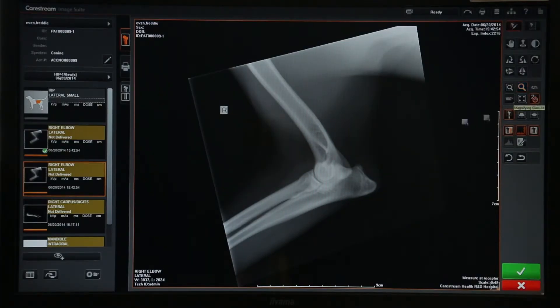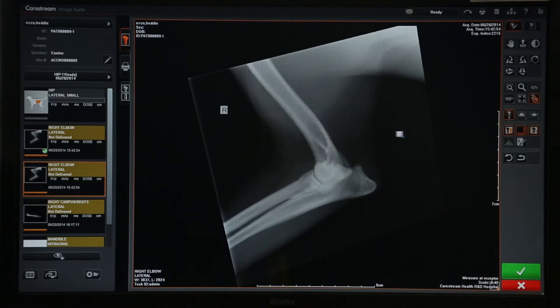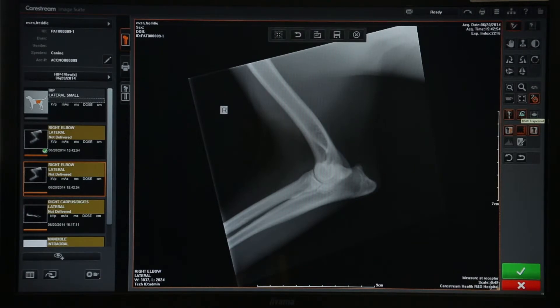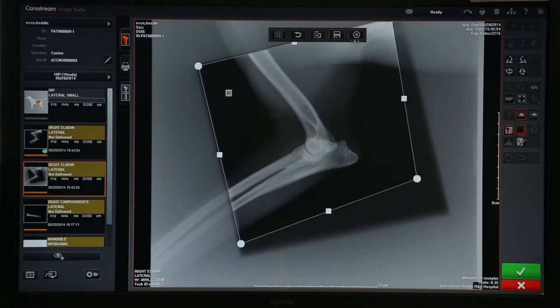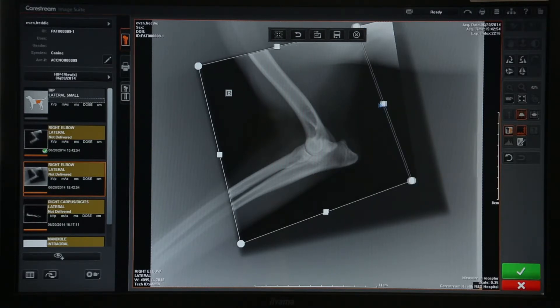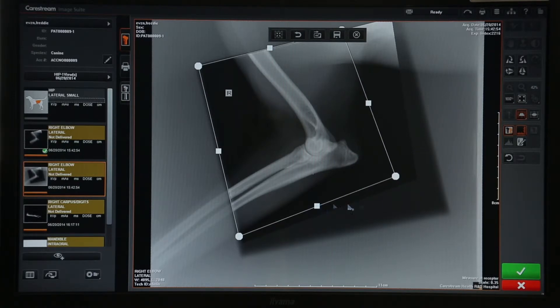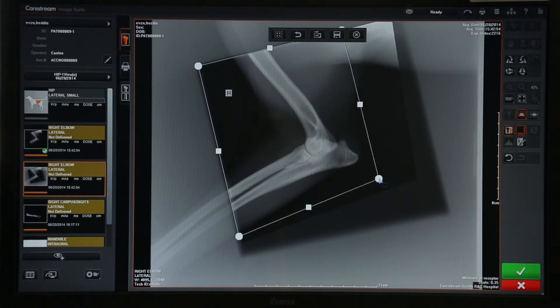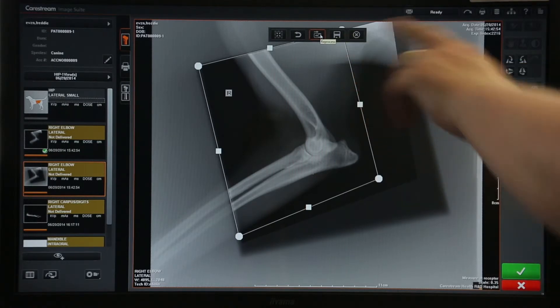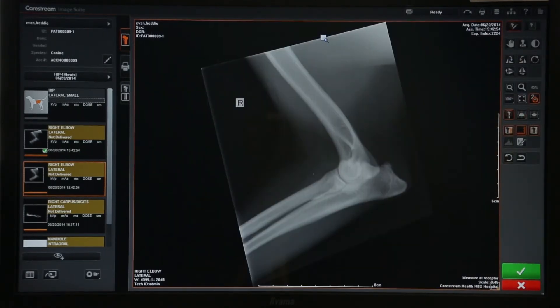You also have an option to use a magnifying glass if you just want to look at part of the picture. Then you have your black surround mask or cropping functions, which enable you to re-crop the picture. This can be really useful if you need to tidy up the picture, and it's well worth playing with to improve image quality. Then you choose reprocess and that tidies the picture up.